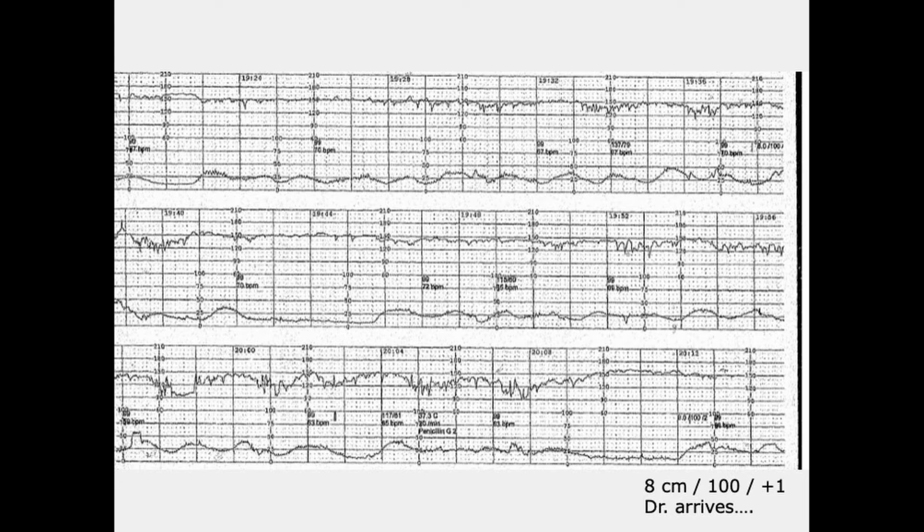Okay, good. So overall, I think if we just glance at this, your overall impression, you see quite a bit of wiggle, and you say moderate. No. And the reason is you cannot look at variability during a deceleration to determine what the baseline variability is. Remember when I said the definition of baseline fetal heart rate is that 2-minute stretch in between. You also, for defining variability, need to look in those same sequences where you're determining the fetal heart rate baseline. Is that wiggle there in those stretches that are relatively constant? You cannot measure variability during a deceleration.